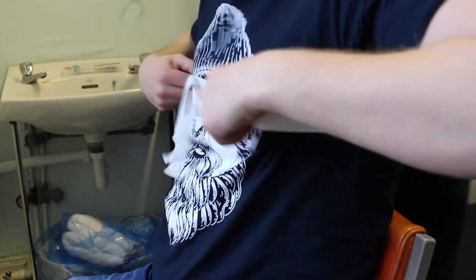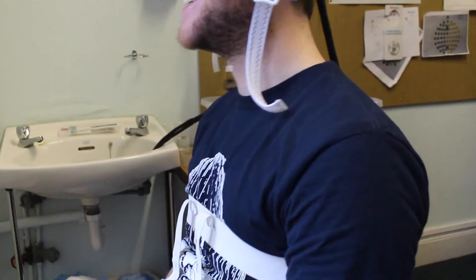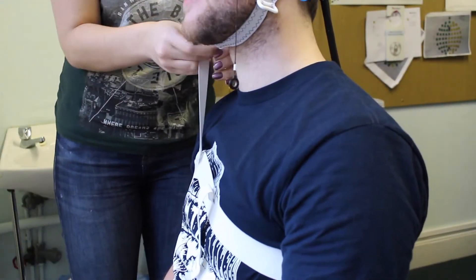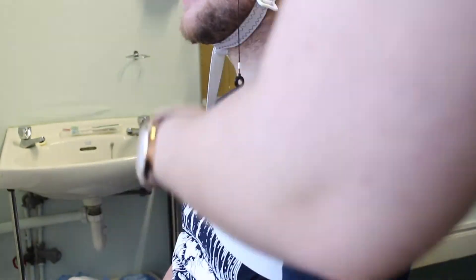Once you are happy with the placement of the cap, do up the chin strap so that the cap is secure, and if desired, you can use a chest strap that will help pull the cap down and make it more comfortable for the participant.